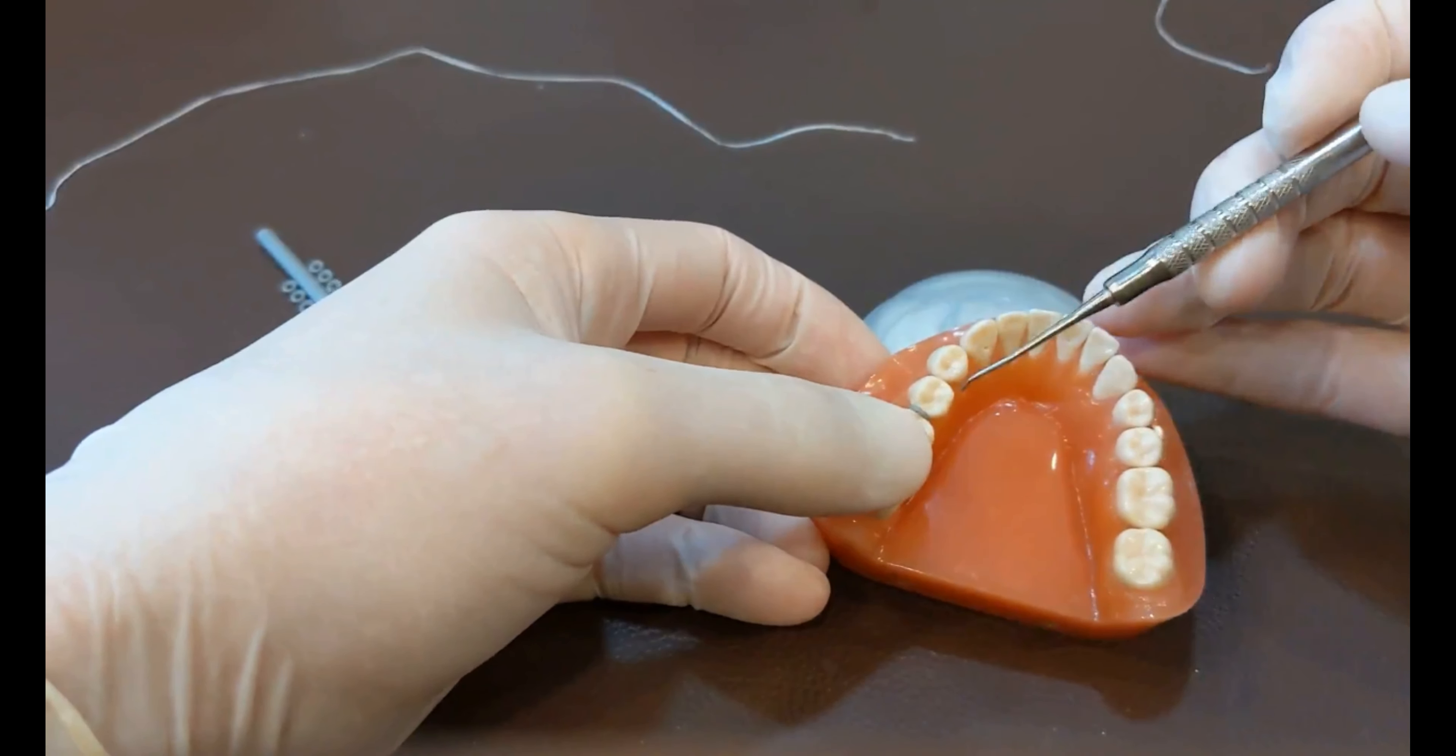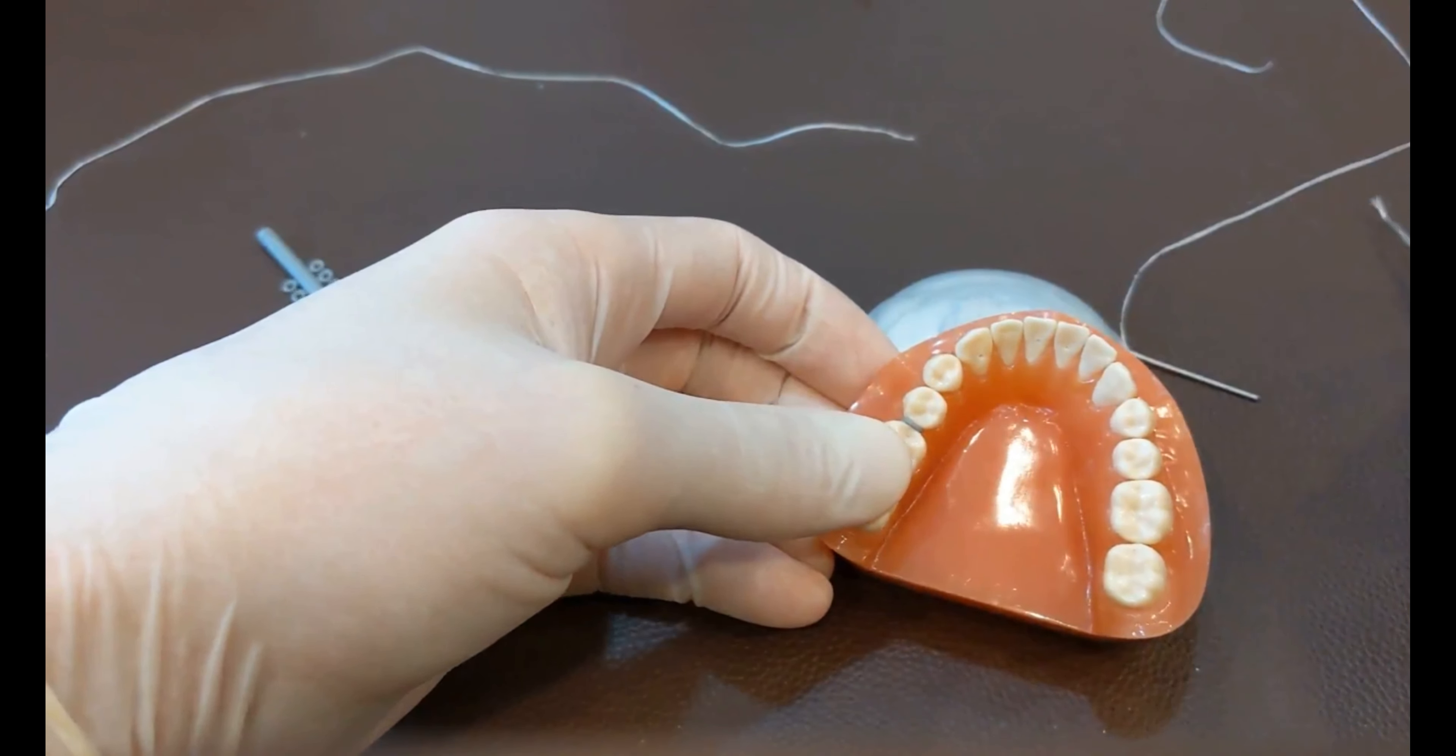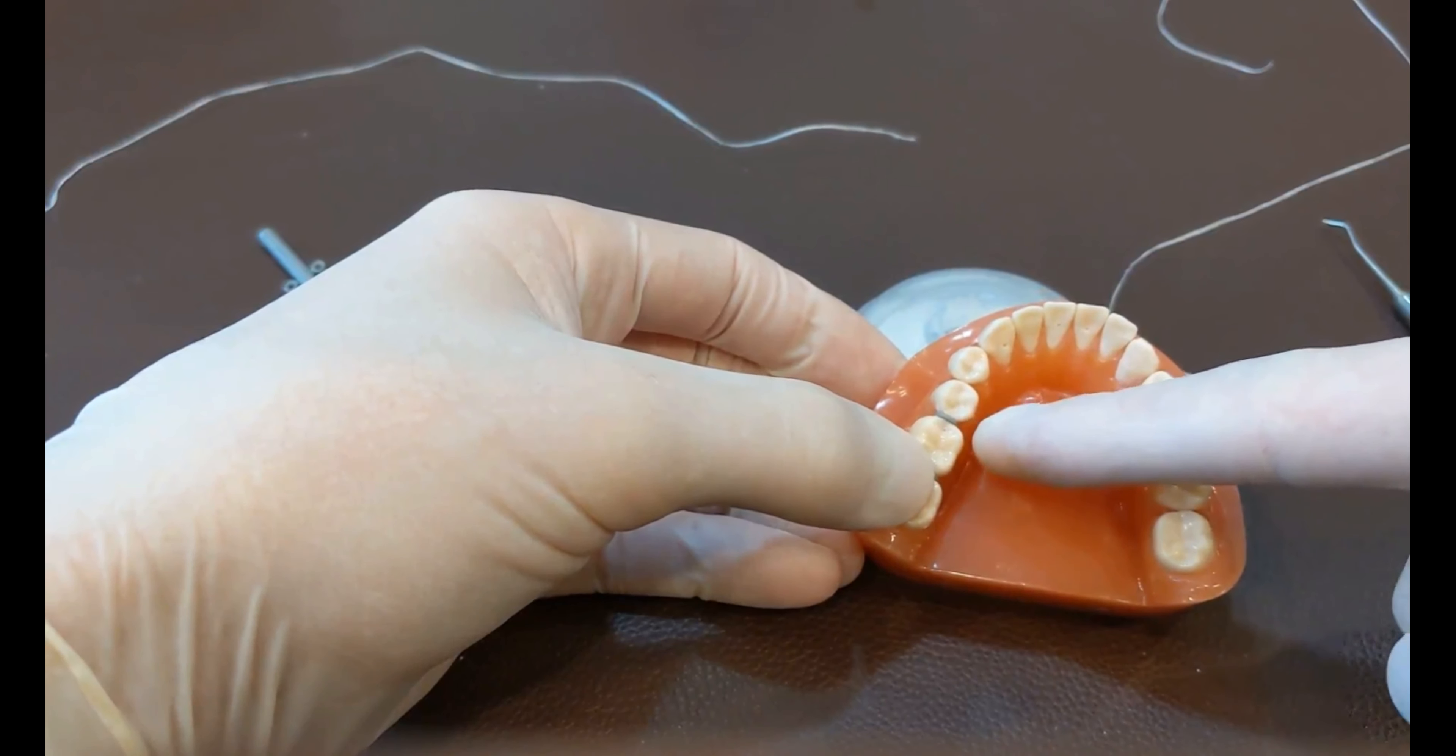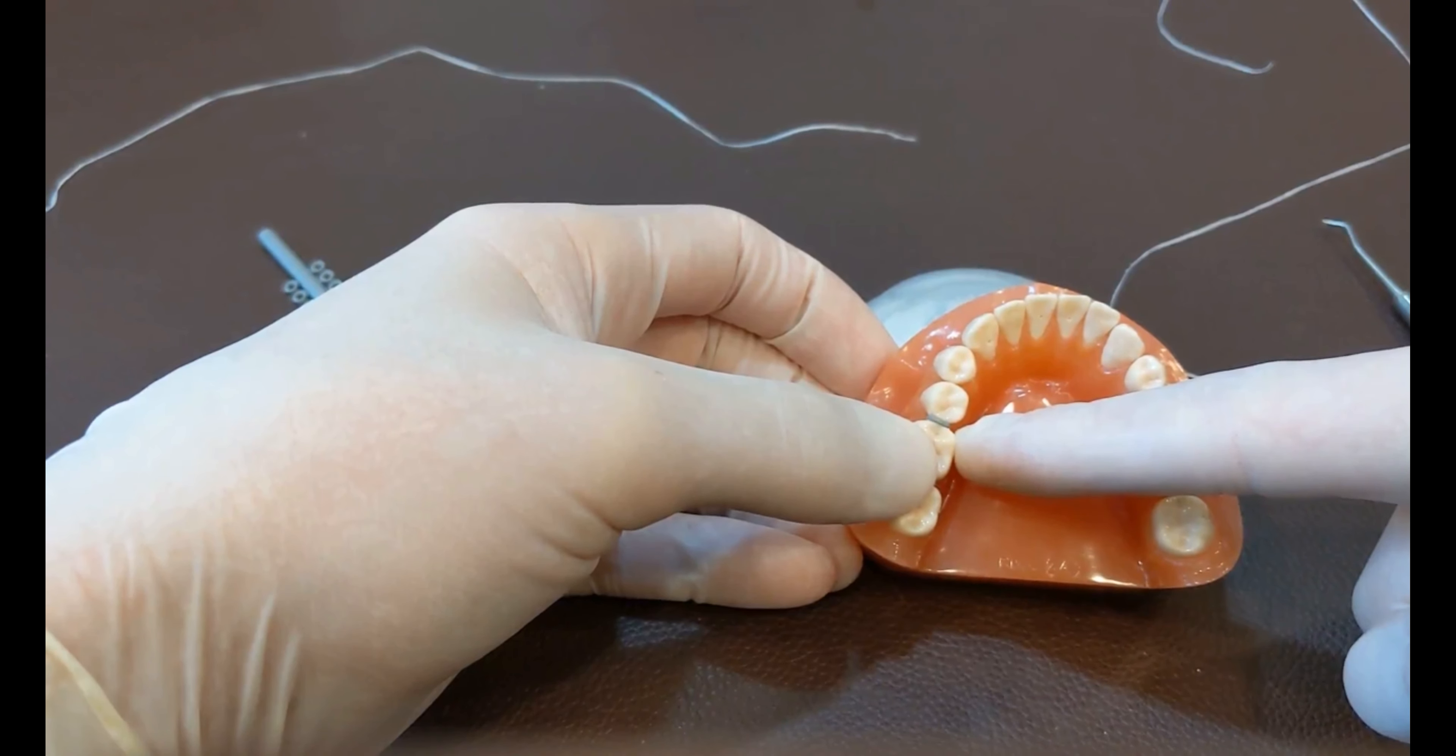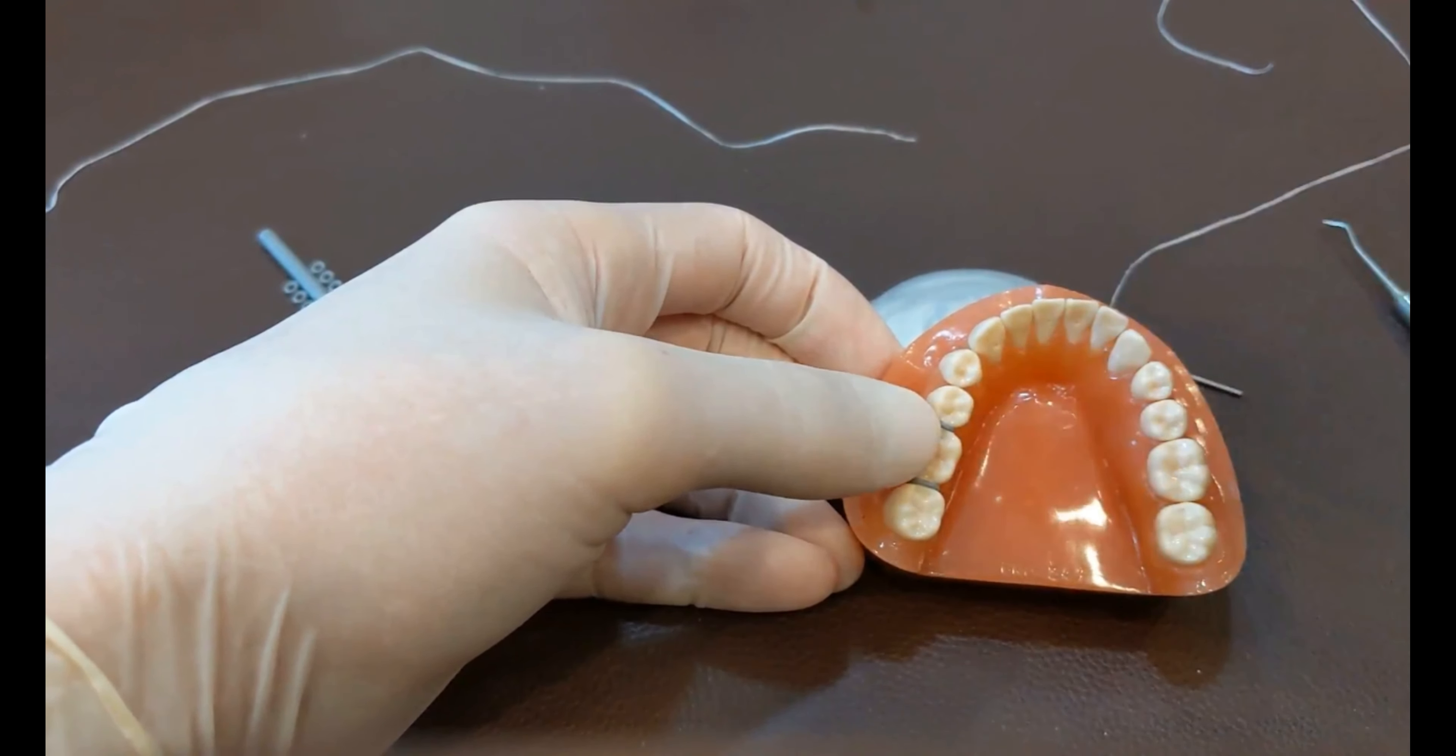And then you want to make sure that part of it is up above the contact and part of it's down below the contact. And that's how you place it with floss. When you slide, I always warn the patient, because when you slide it down below the gums, they'll feel pressure. So I'll usually say, you'll feel this going in, you'll feel some pressure, it'll be a little uncomfortable, just hang in there and it'll only last a second. Because it hurts a little bit for some people. So that's how you place it with the floss.